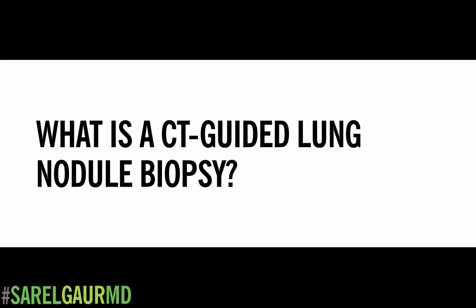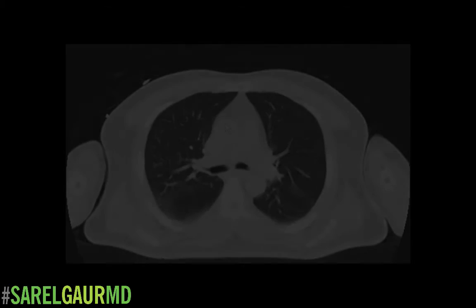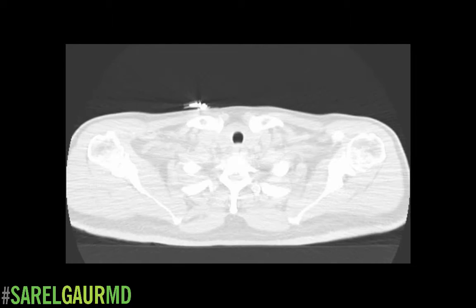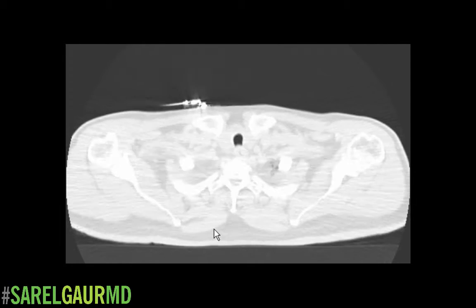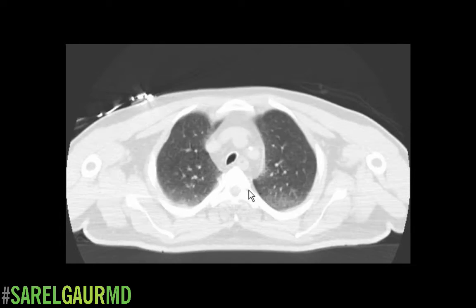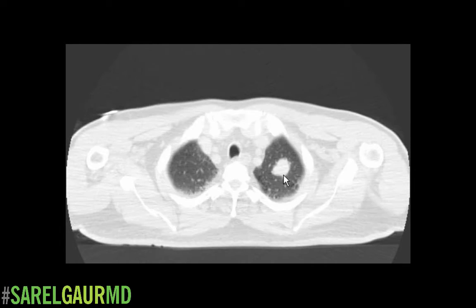The first thing that happens is the patient is placed on a CT table and scanned. Here is the first scan. Here you can see a nodule in the left upper lobe, and this is the nodule we are targeting for biopsy.